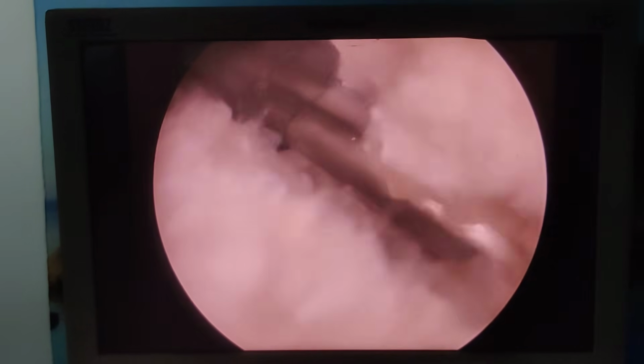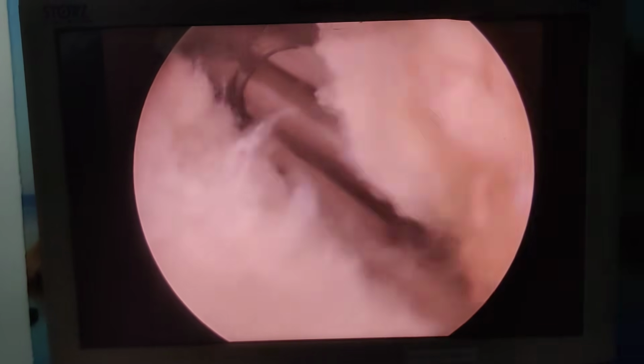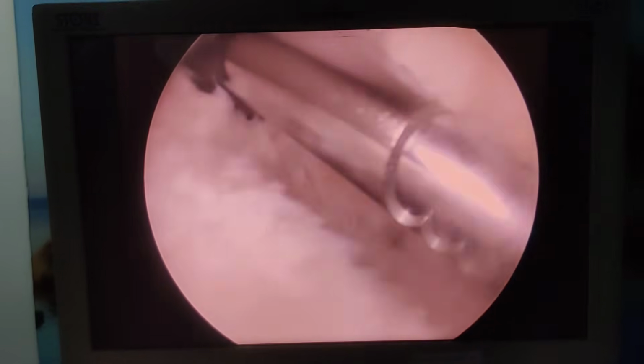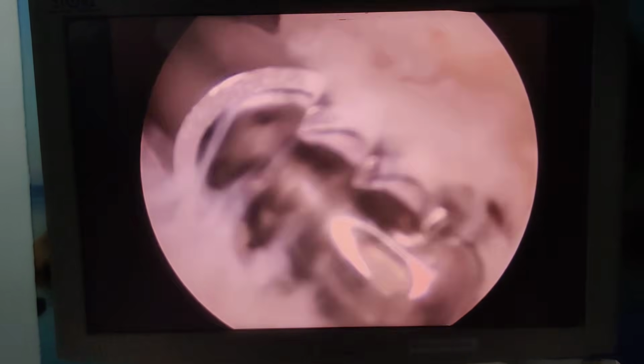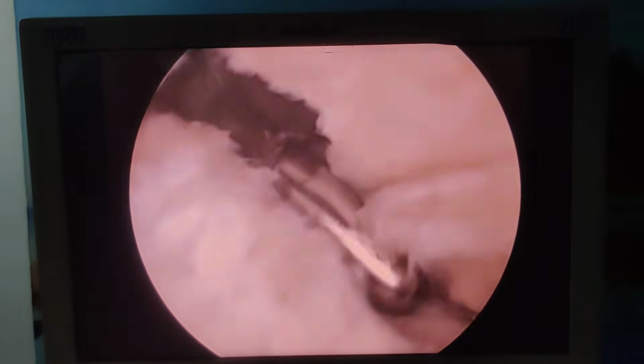Now when we do PCL, it's all about the killer turn. So our entry, if you are using the transtibial technique, should be slightly lateral to the midline, because then the killer turn will not be that acute, and also it should be low down. So to avoid the killer turn of the graft, two things. One, the graft entry should be low, and hopefully I will show you on the C-arm, and also it should be slightly lateral to the midline.